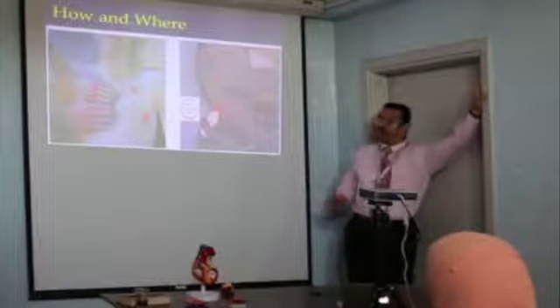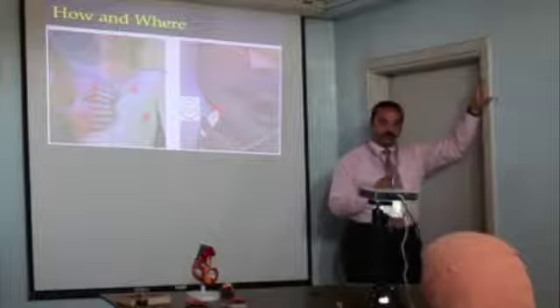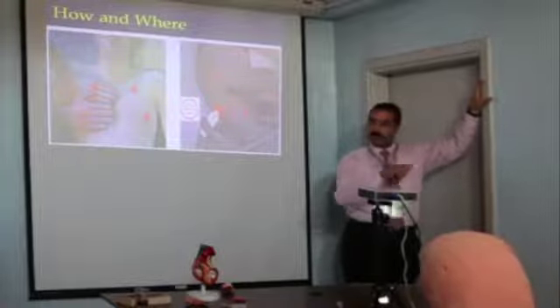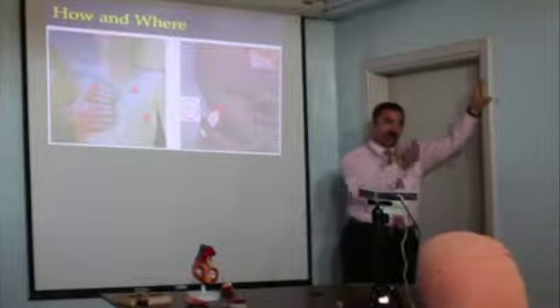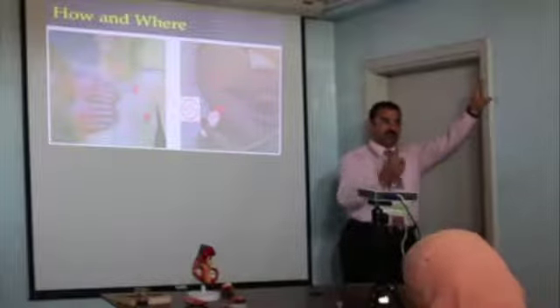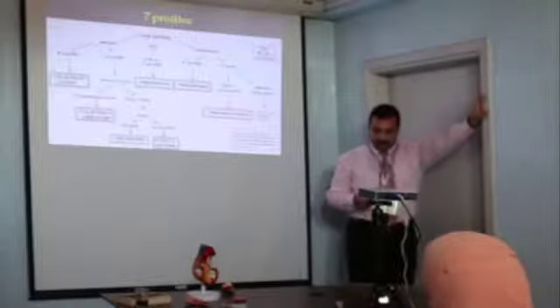Here, this is the PLAPS point, the posterior lateral point, and in this one we usually use a curvilinear or phased array probe because we need more tissue penetration. Plus, complete the puzzle with different probes in different areas, in the heart, in the EFAST, whatever. You can also do an ultrasound of the diaphragm to get some clues.